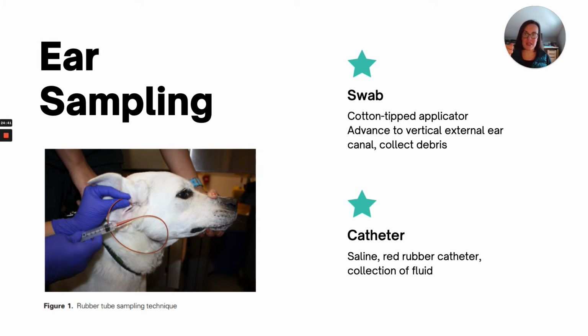So sampling the ear and how to do that is something that's important to make sure that you're, again, just pulling up on the pinna so that it spreads out the cartilage and reduces the size of that prominence, which can be painful if you touch that with a Q-tip or cotton-tipped applicator or your otoscope. But again, getting a swab from that section of the ear should be very useful to determine inflammation and to determine whether there's bacteria or not.